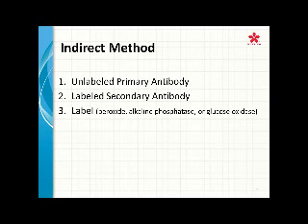You're going to retrieve your epitope by either heat-induced or enzyme-induced, or both heat and enzyme-induced. Then in this detection, you're going to apply your primary antibody, which is the antibody that you're trying to detect. It has to have specificity against the antigen in question. So if you're trying to detect a CD3 or CD4, this is your primary antibody.